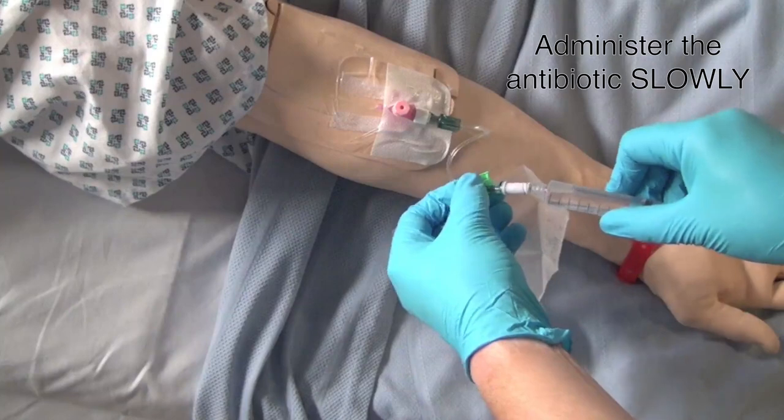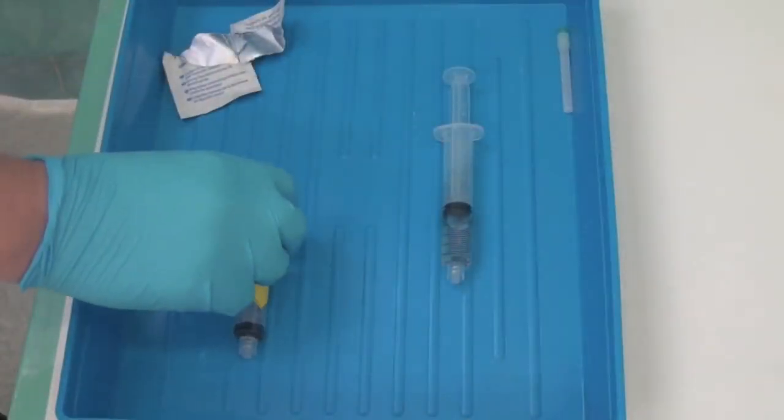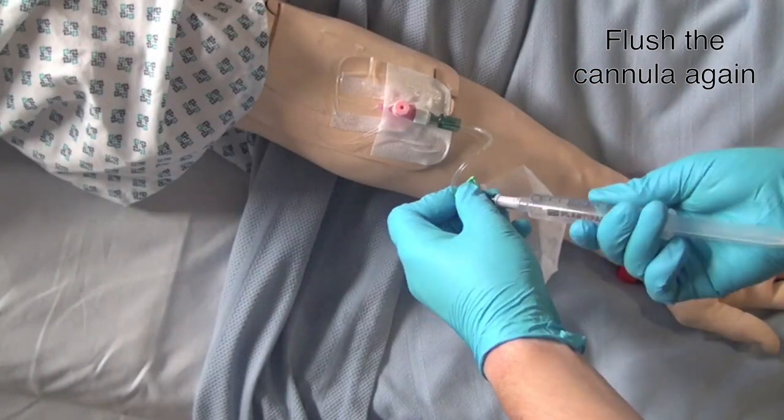Slowly bolus the antibiotic, observing the patient as you do. When you've finished administering the antibiotic, flush your cannula again.